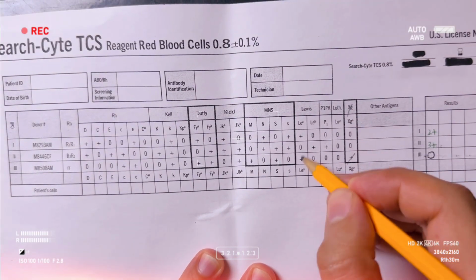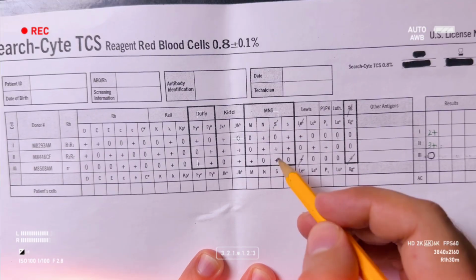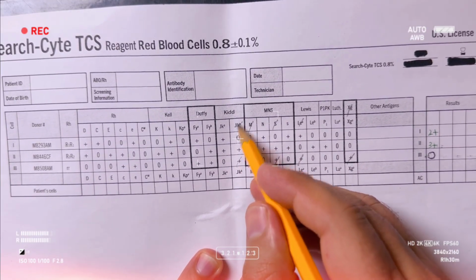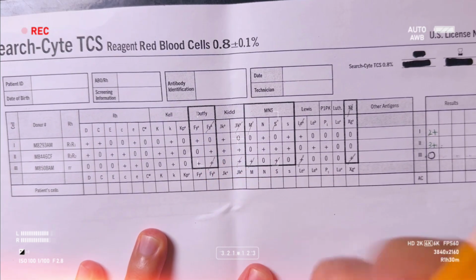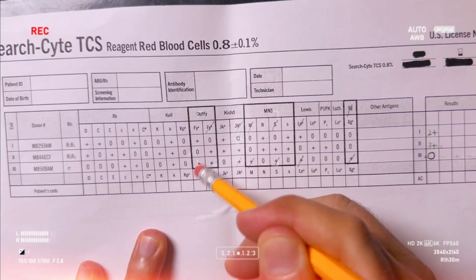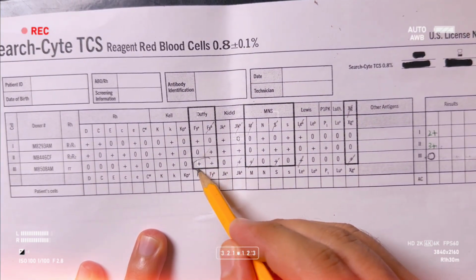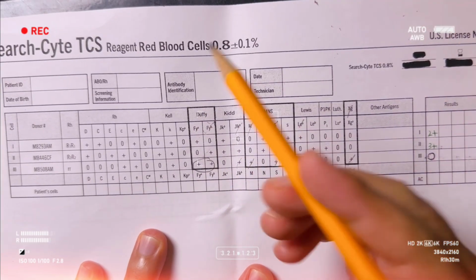So I rule out big S, M, JKB, Duffy B. Oh, we cannot use that because it's one heterozygous, not homozygous, so we have to wait for another panel to rule out the Duffy.